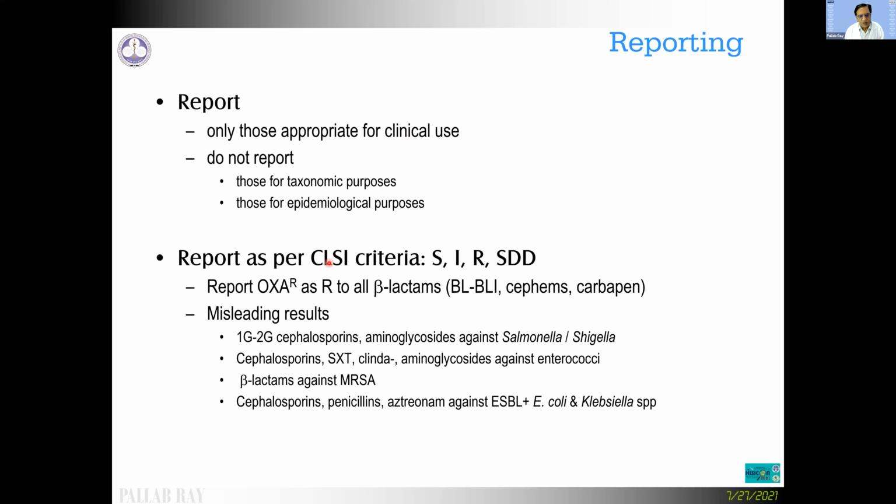Always report as per CLSI criteria: sensitive, intermediate, resistant, or SDD, sensitive dose dependent. Report oxacillin resistant as resistant to all beta-lactams. There will be more discussion about all these extra comments. Do not report misleading results. For example, first generation to second generation cephalosporins or aminoglycosides in Salmonella or Shigella, even if they turn out to be sensitive. Similarly, there are many other situations which probably there will be much more detailed discussion on later. So I won't go into more details about it.